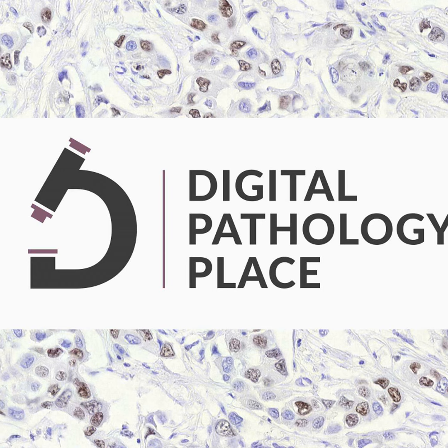But sometimes vets think, oh, I don't want to give her too many because I don't want her to have to look at too many. So the communication is, yes, I want to see a lot, because you increase the likelihood that we're going to have a diagnostic case, or at least some helpful information, if not straight up diagnostic. There's actually a paper published in the past 5 years in Veterinary Clinical Pathology that looked at the utility of static telecytology. They found that submission of at least 5 or more photos increased the accuracy of diagnosis. So there's data to support that.